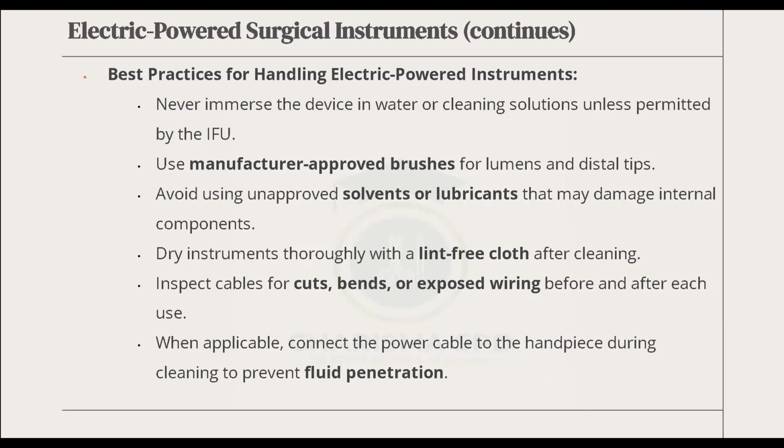Thank you so much. So that is why you cannot use any lubricant other than the one recommended by the manufacturer. Dry lint comes from the towels that we use, sometimes the sponges we use to do the hand washing in the decontamination area.